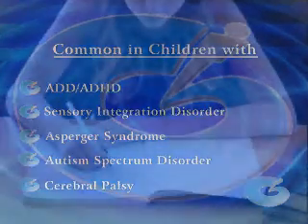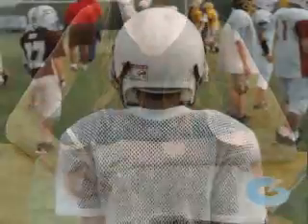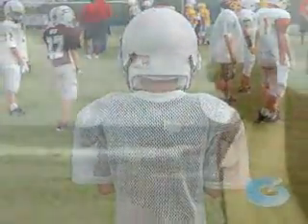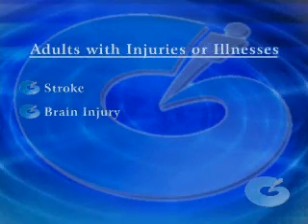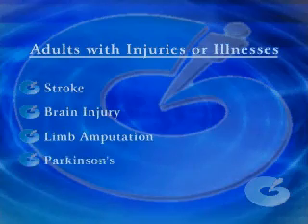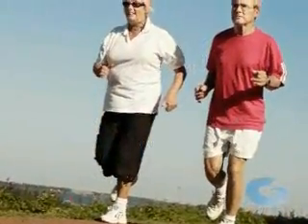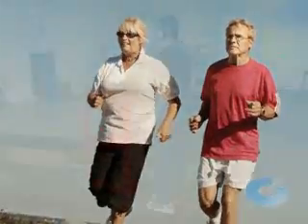Children with these diagnoses may experience problems concentrating in school, following multi-step instructions, or controlling impulsivity. We have also found that another group of patients who show difficulties with motor planning and sequencing are adults with an acquired injury or illness such as stroke, brain injury, limb amputation, or Parkinson's. These problems may result in difficulty concentrating, walking independently, or in activities of daily living.